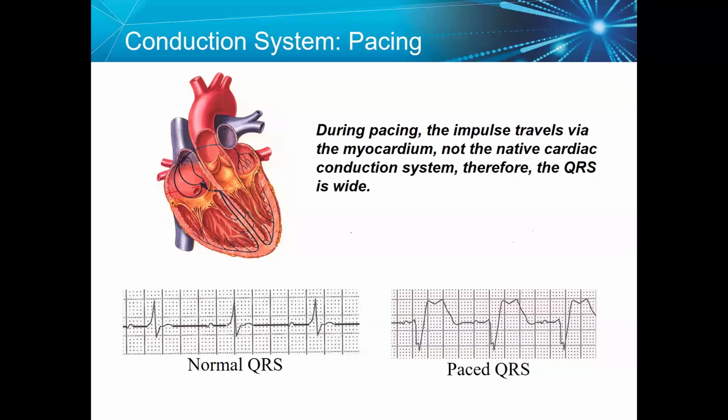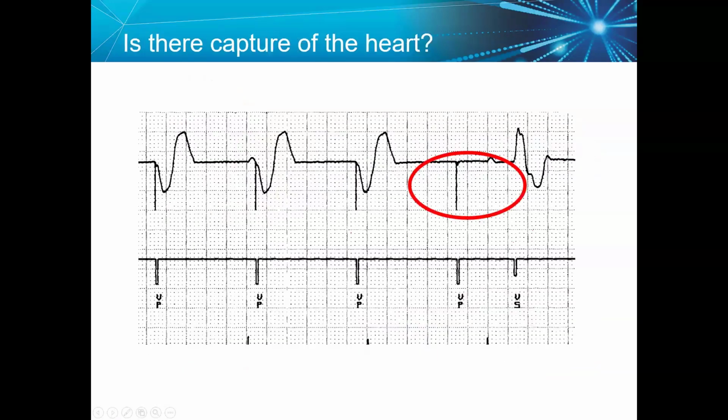After implantation with these techniques, we show a very narrow QRS and mostly the same axis as normal sinus rhythm.